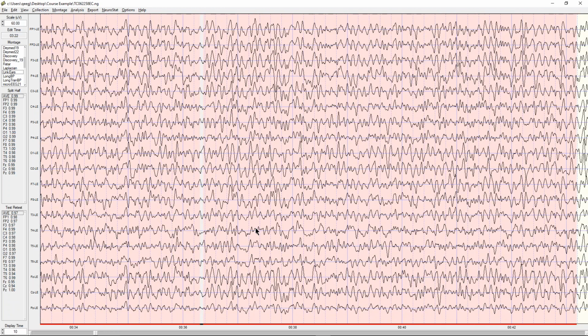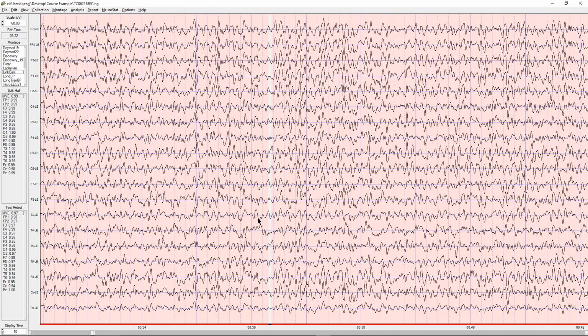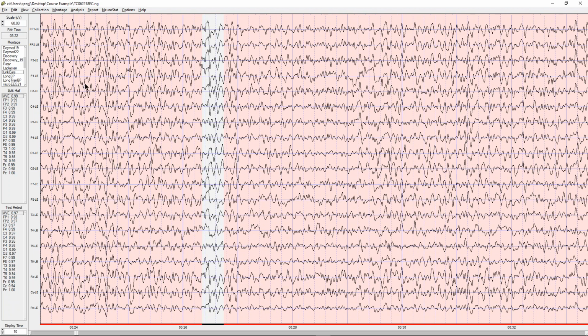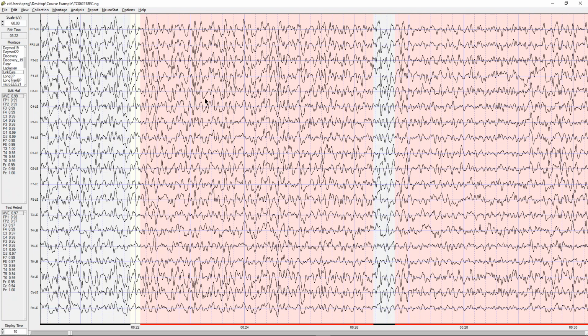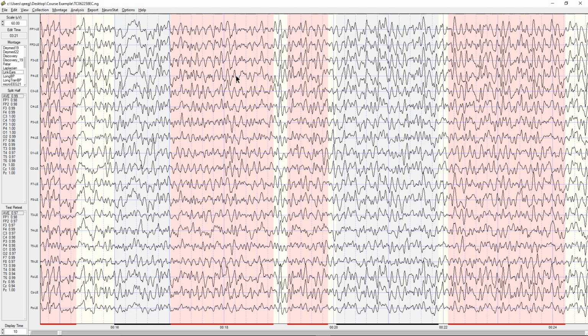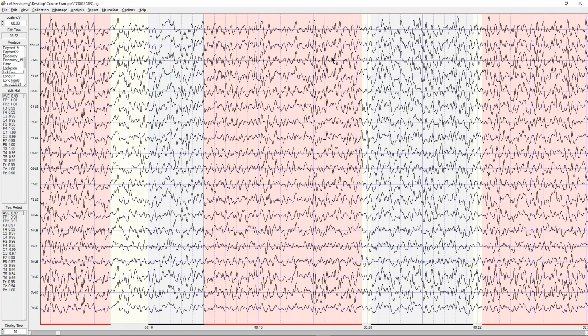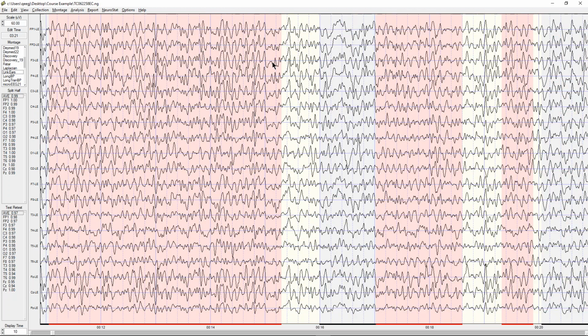Sometimes it's just a matter of, I'm not sure about that, but in an excess of caution. And because I've got 3 minutes and 22 seconds of data and I only need 2 minutes, I'm going to be more picky, and I'm going to throw out more stuff that might be real EEG, just to be sure that I'm not including abnormal EEG at the same time.